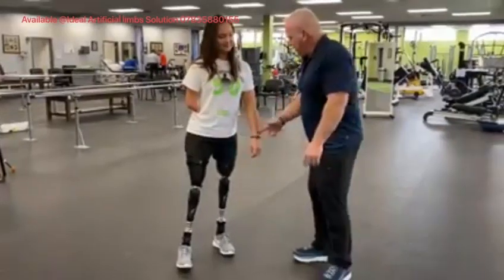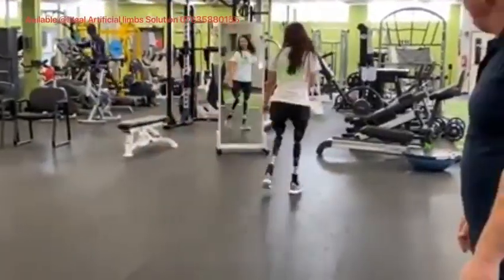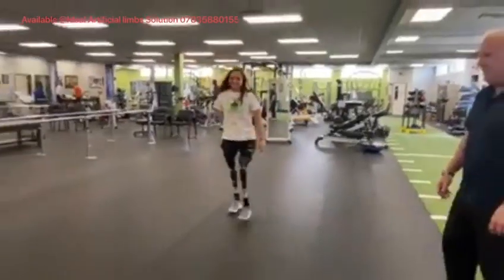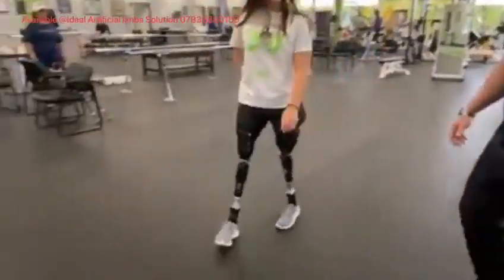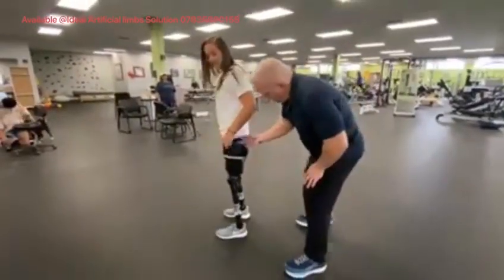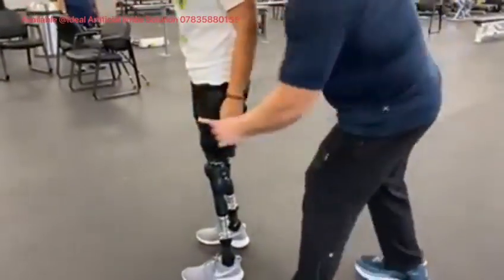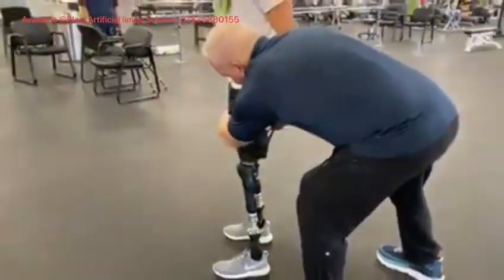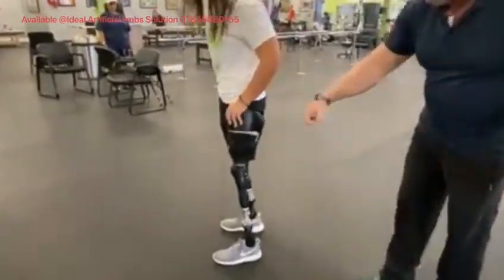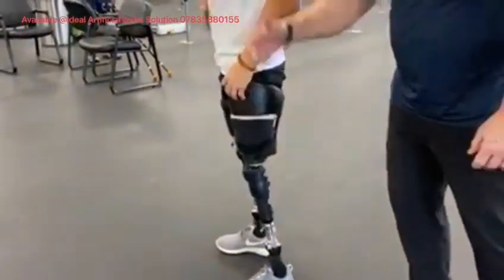Can you walk for us first? You can see how the strut straightened up. Let's show what happens from the side here. So here is the socket, and then we have the strut and the lower socket. What happens is this allows Ryan's muscles on both sides to fire. You can see how that flexes — as that flexes, this straightens up and allows the push.